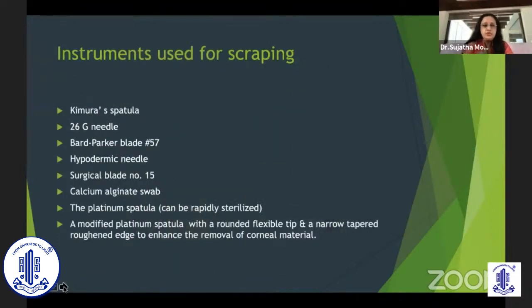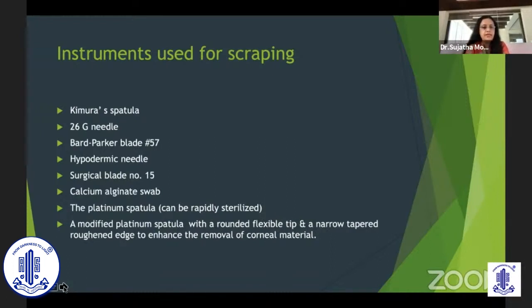The instruments used for scraping are normally the Kimura spatula, a 26 gauge needle which has to be handled very carefully, a hypodermic needle, a Bard-Parker blade. Surgical blade number 15 is probably my choice of instrument for scraping. A calcium alginate swab and a platinum spatula which has a rounded flexible tip can also be used.